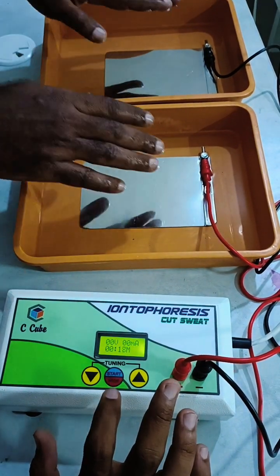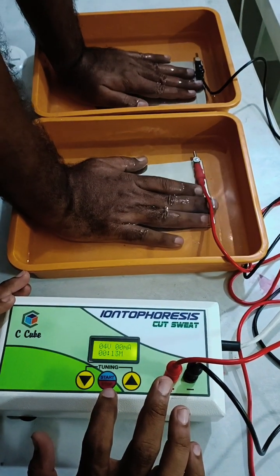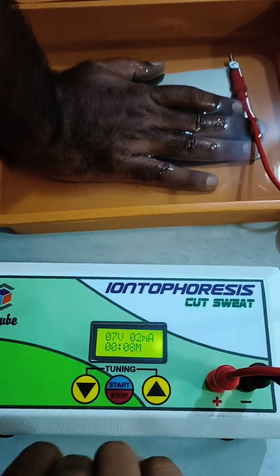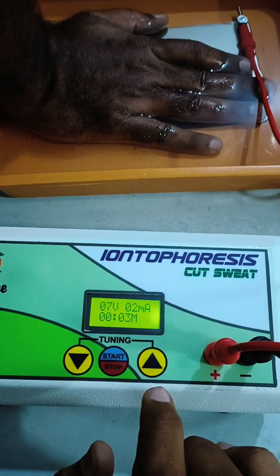The device has started. Rest your hand within 5 to 8 seconds. The timer will decrement again, and you can see the required voltage and current being delivered incrementally. Once it reaches zero, the unit will turn off automatically.